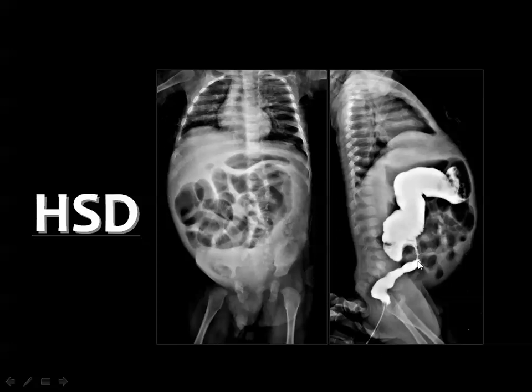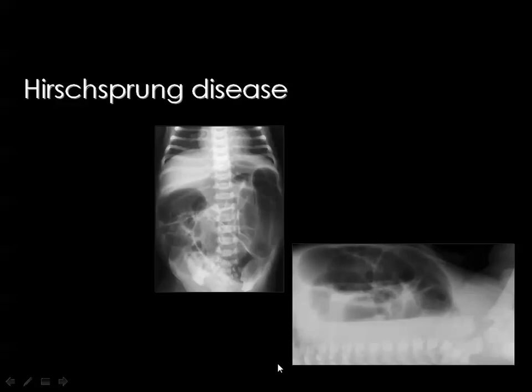Then you may aggravate the patient's condition and complicate the status of the patient. This is the rectum, and this is the narrowed segment. This is the sigmoid, which is distended. Then you stop here, so as not to continue filling the colon with barium. This is a sort of intestinal obstruction, including the colon and the small bowel.